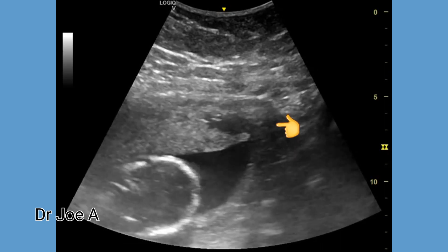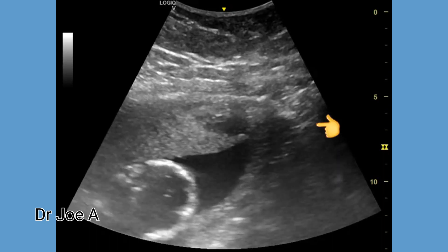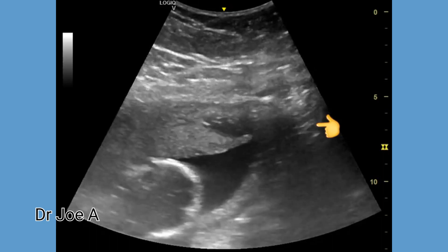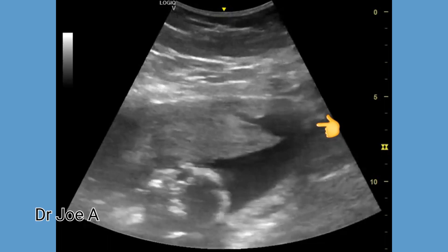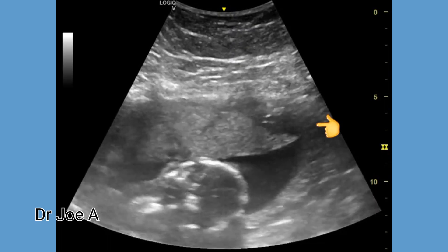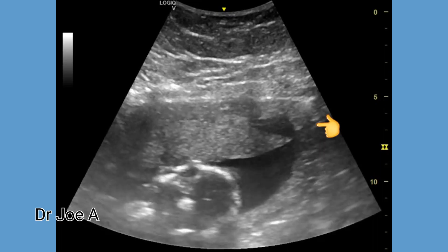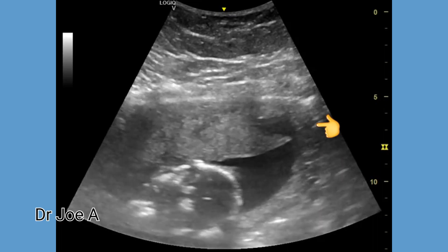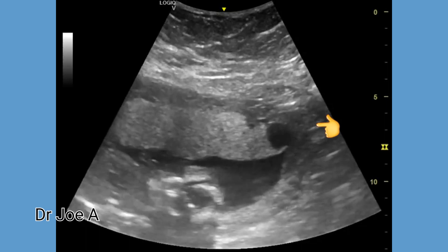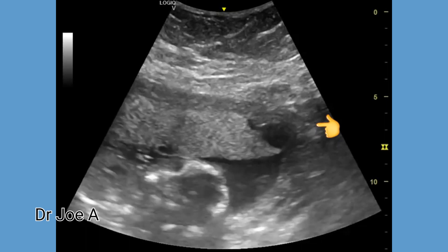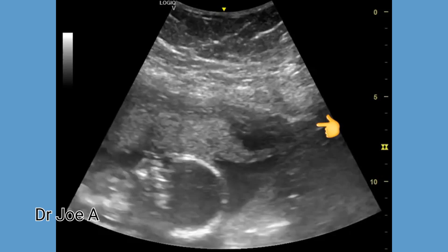Follow-up ultrasound has been advised in this patient. Another important differential diagnosis in such cases is placental venous lakes. Placental lakes are also anechoic or hypoechoic, but they occur within the body of the placenta and not between the placenta and the uterine walls.